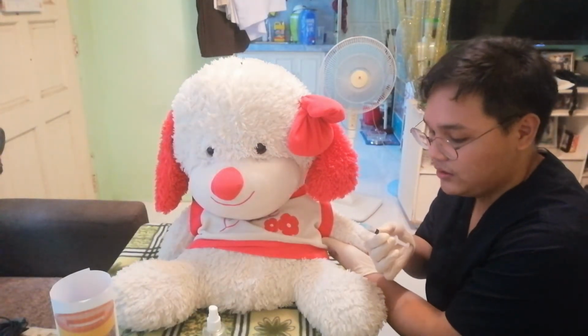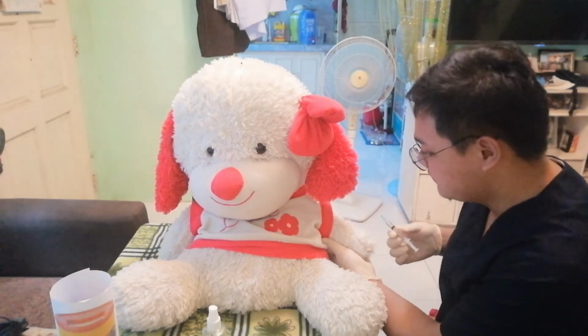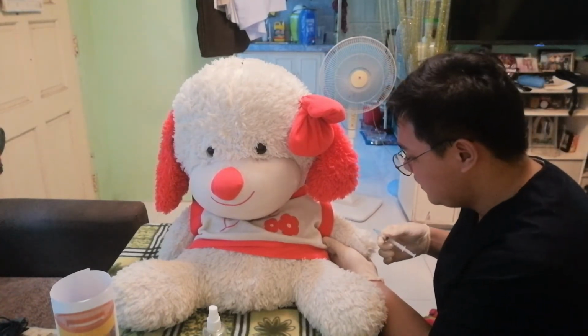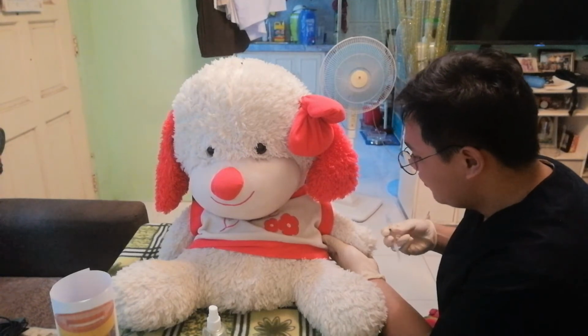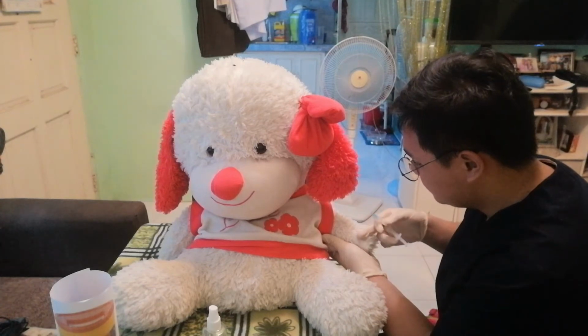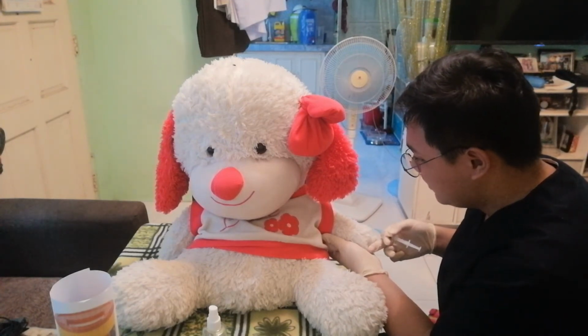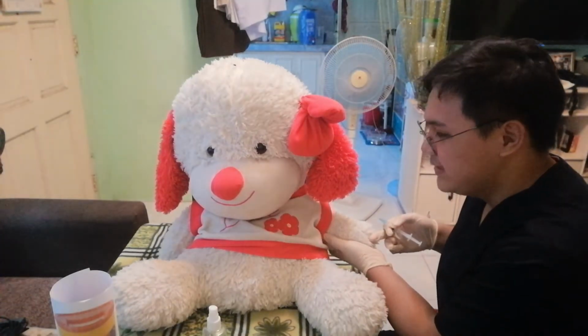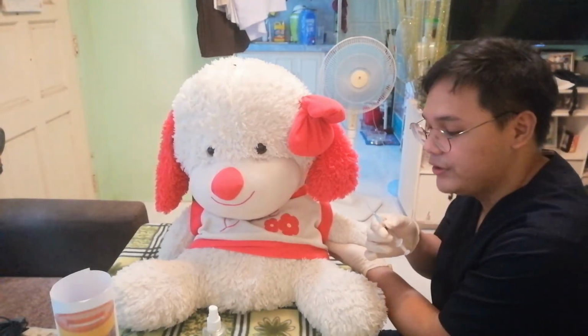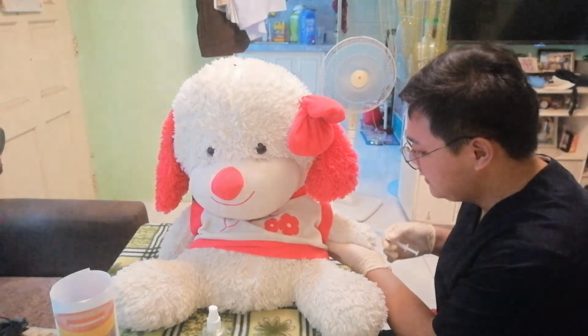And after that, we need to place the needle, or the syringe, almost against the client's skin. It is at a 5 to 15 degree angle to the client's skin with the bevel side up. And after that, we need to inject into the client's skin so that the point of our needle can be seen through the skin.